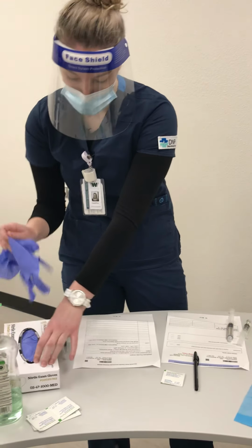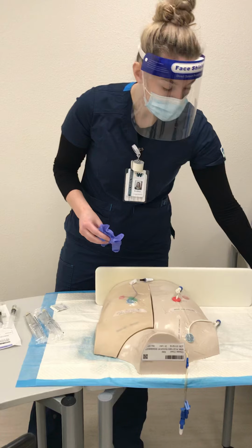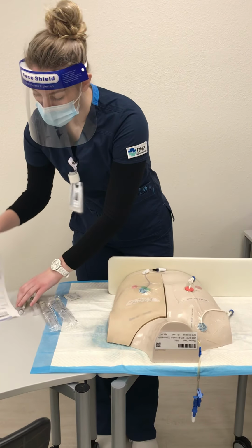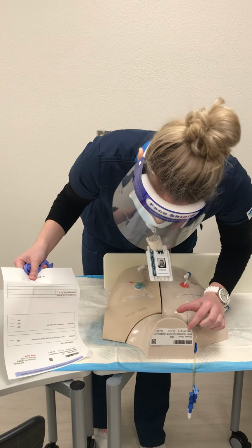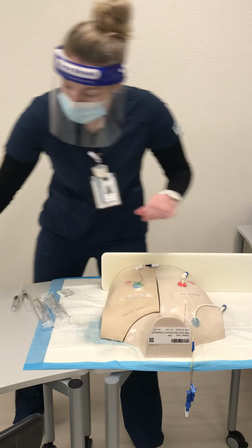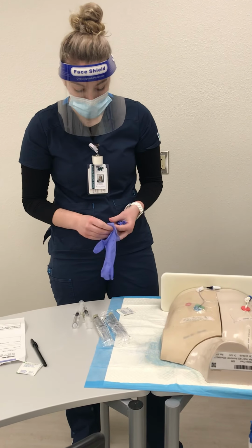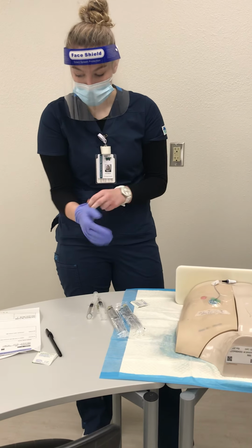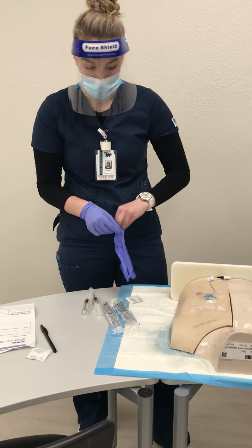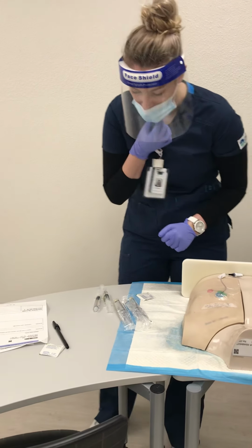room again. So I greet my client again, and I would ask them to confirm their name and date of birth for me. So Chester Chess, 7/19 of 19. Okay, Chester, so I have some medication here for you. It's ceftriaxone, so it's for your current infection you have. Do you have any questions about the medication? You don't. Okay, you've been getting it for a few days. Okay, I see your last dose was 8 hours ago, so we're okay to give this again.